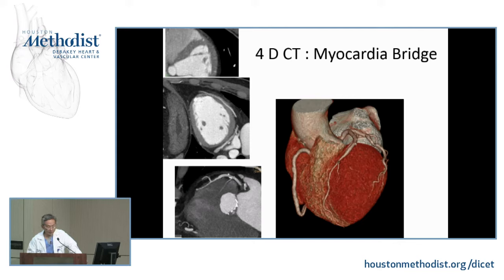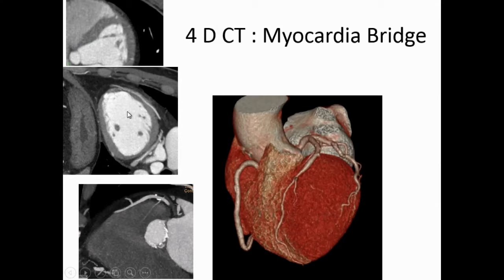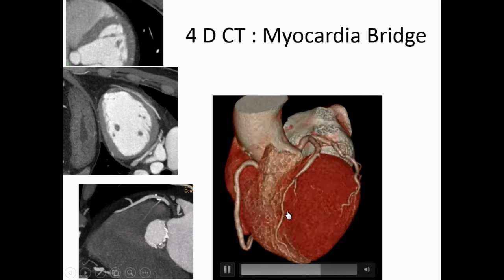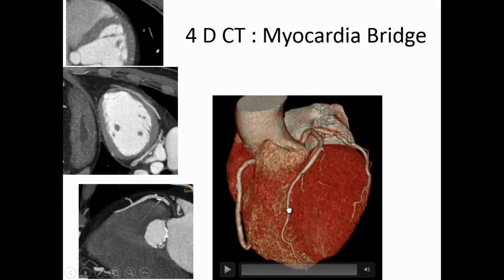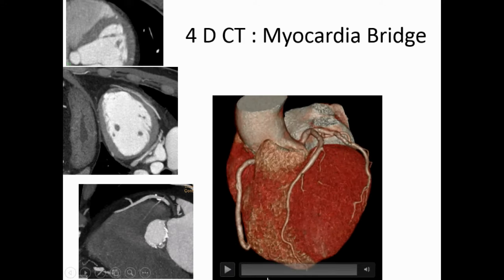And not only that, occasionally we do these interesting cases. We can apply 4D CT. The only application I can come up with is this patient with myocardial bridge. Obviously, you can see clearly during systole the mid LAD is being squeezed here. So just for fun, not terribly useful.